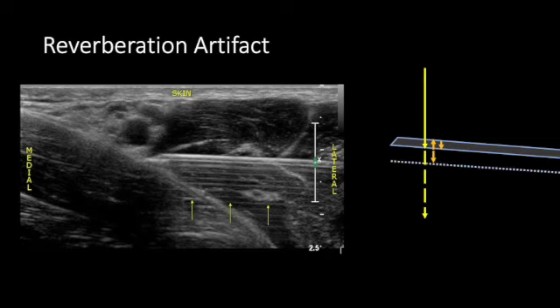But what the ultrasound machine doesn't understand is it takes all things into consideration, but mainly time. So to calculate the depth of something, we measure how long it takes for the ultrasound beam to come back up to the transducer. And in this case, that little side trek of these two reflections inside the hollow needle before those echoes were able to make it back caused the machine to think that there was something at a slightly deeper depth.